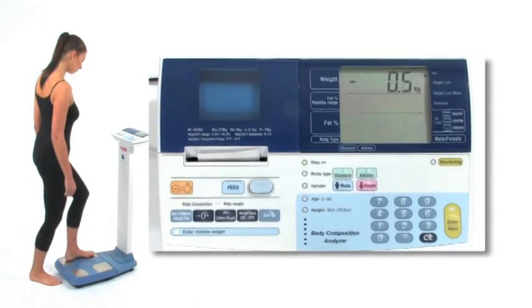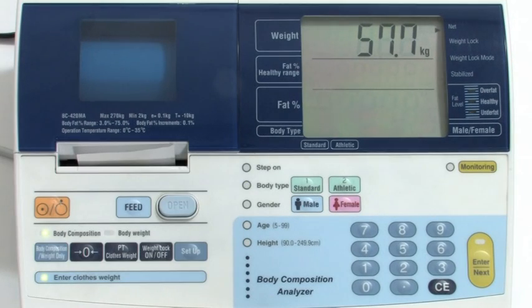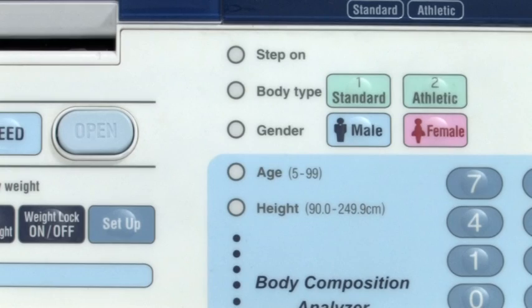Step on will then flash. The user should then step on with bare feet. The weight will then be displayed. Body type will then flash. Select athletic if the user carries out more than 10 hours of cardio exercise per week and has under 60 heartbeats per minute. All other users should select standard.